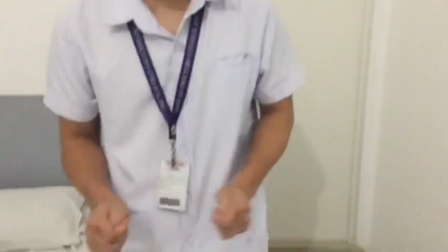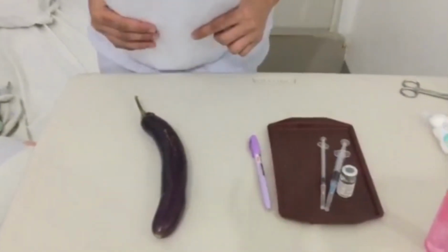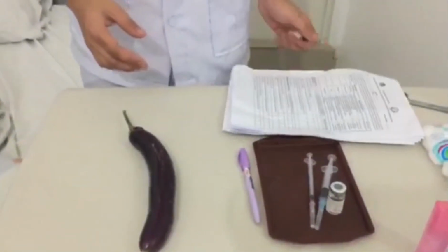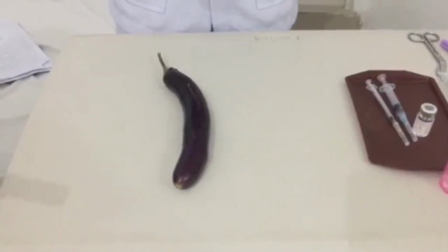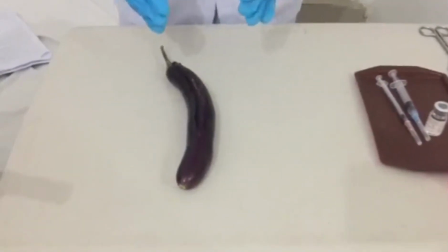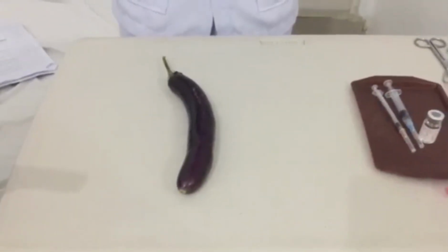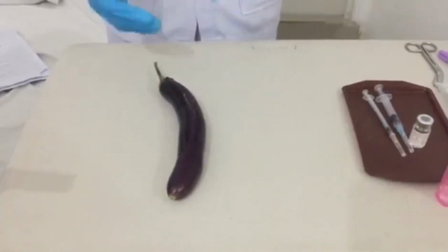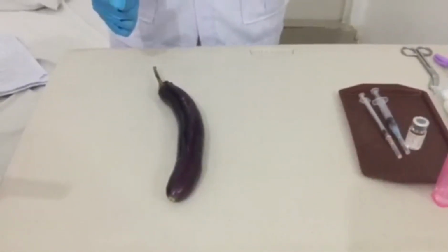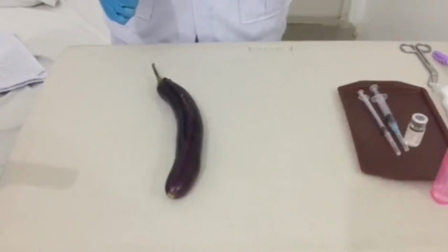So now I will be preparing the medication. And then perform hand hygiene. And then select, locate, and cleanse the site. Select a site free of skin lesions, tenderness, swelling, hardness, or localized inflammation, and one that has not been used frequently. If injections are to be frequent, alternate sites and avoid using the same site twice in a row.